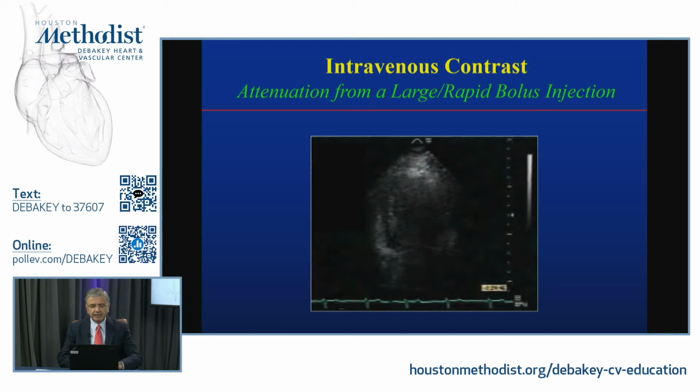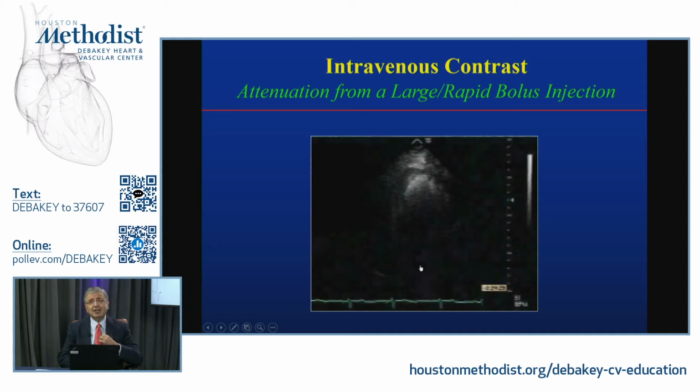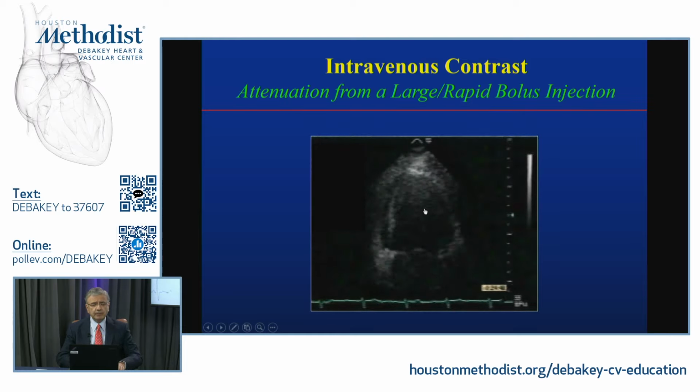And so it's now coming into the left ventricle, very nice, right? But watch, if that contrast was highly concentrated and a large bolus, you're going to start seeing the attenuation that is less during systole. Why? Because you're ejecting quite a bit of this contrast. Now, I'm not seeing much behind it. Not that I'm not injecting enough. Actually, I'm injecting too much. It is highly concentrated, so all the contrast is reflected at this border. Why? Because the intensity and the concentration is much larger below.